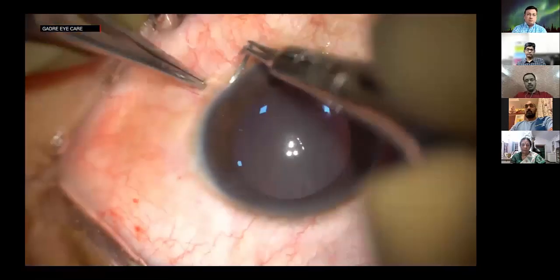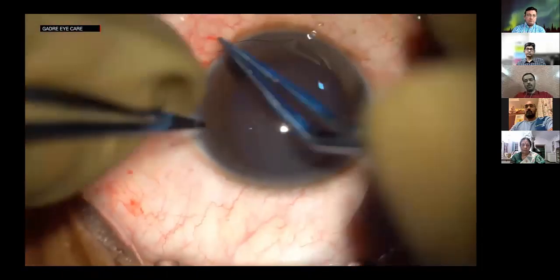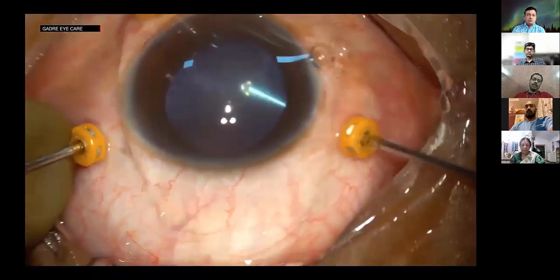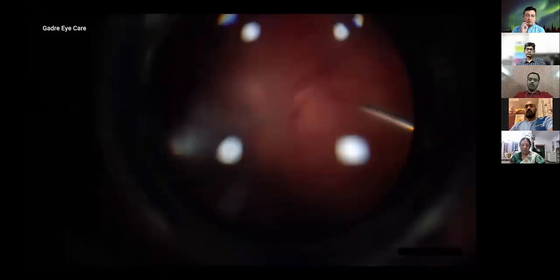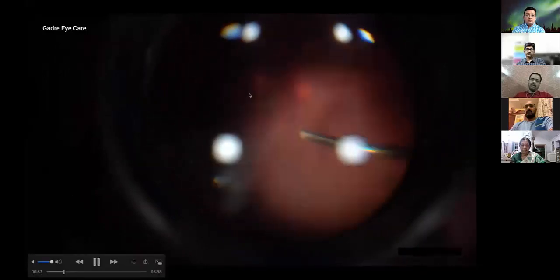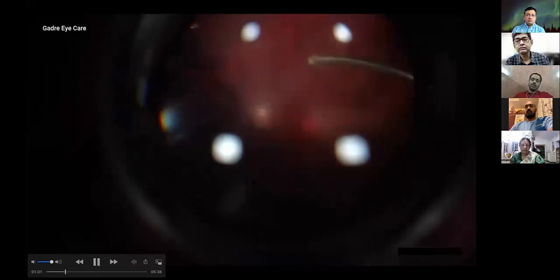So going to the video, it's imperative to seal this small tear since the IOP fluctuations during surgery might cause it to leak, and then suturing it might be a little difficult. We started with 3-port 23 gauge pars plana vitrectomy. The vitreous hemorrhage was cleared. You can see the yellowish spot that is seen at the fovea, which might show the site of impact.